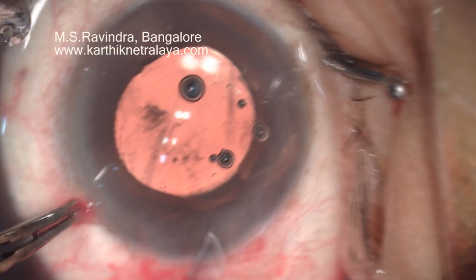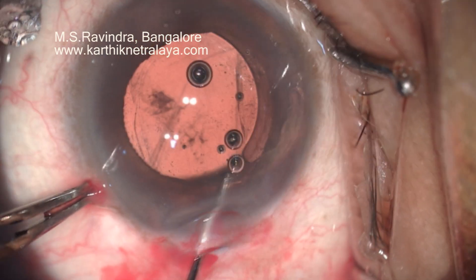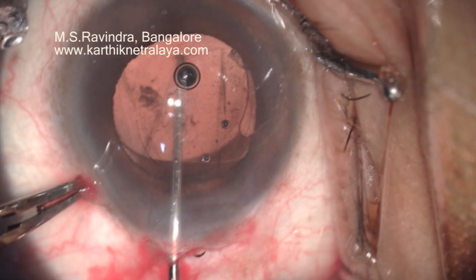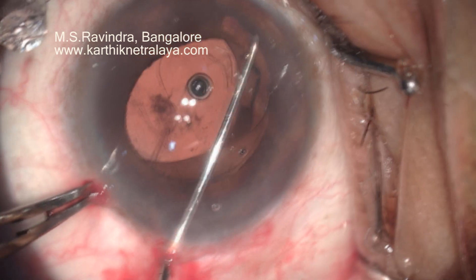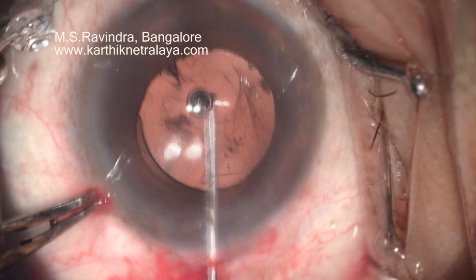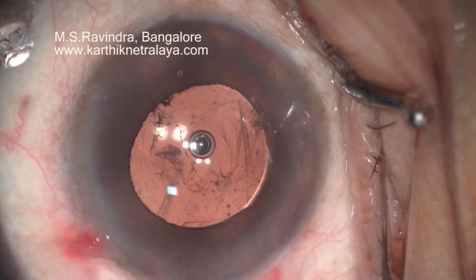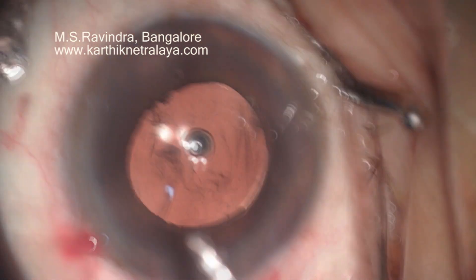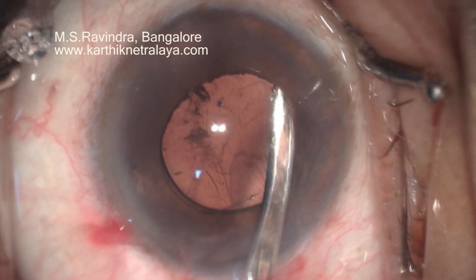I am going to flex it now and place the tip of the haptic in the sulcus. There is some bulging of the posterior capsular tear, but still there is no loss of vitreous. I have carefully positioned the tip of the haptic in the sulcus. Now both haptics are in the sulcus, and I am sure that the optic is well placed in the center.